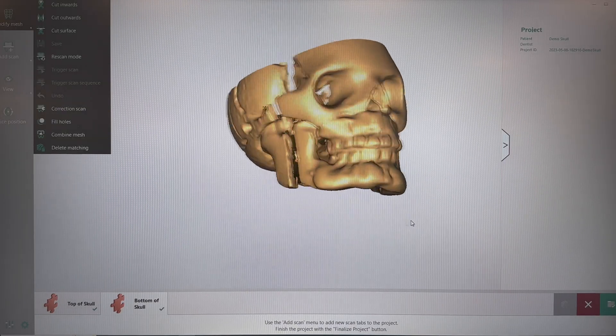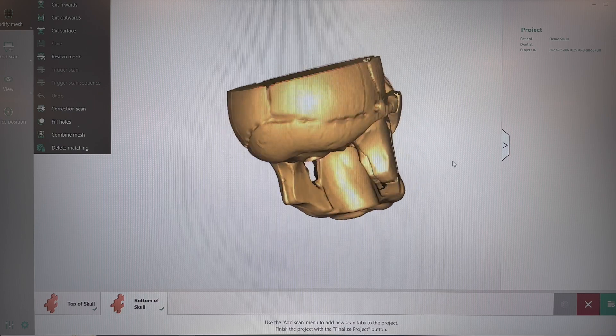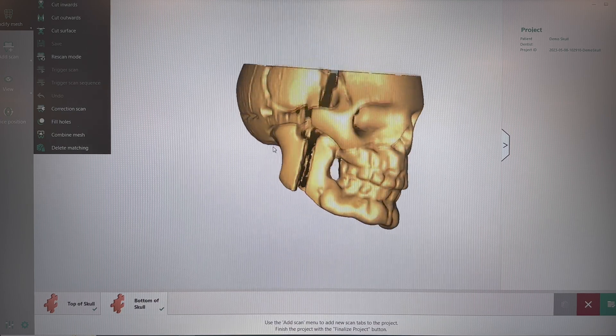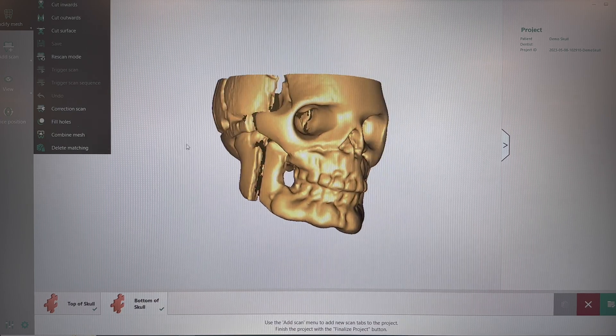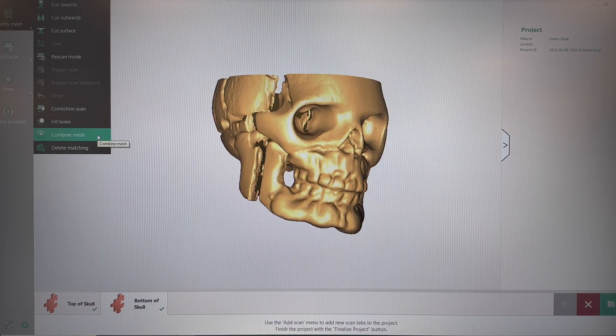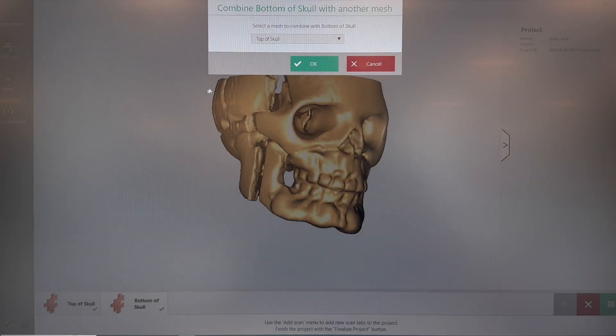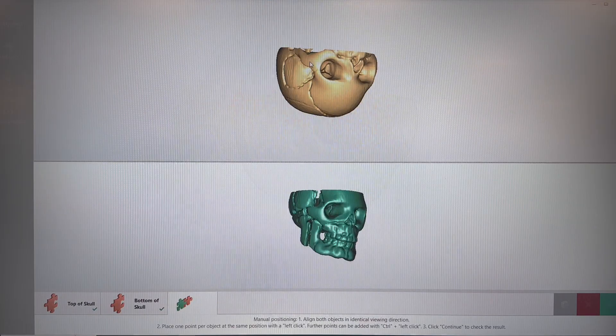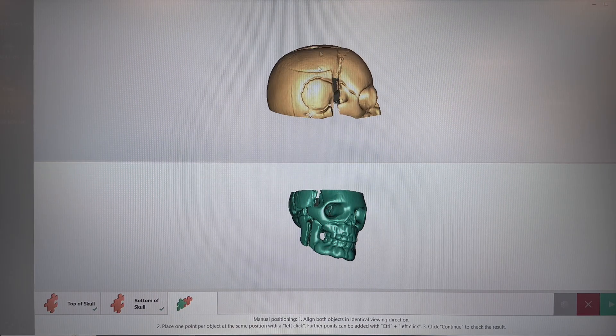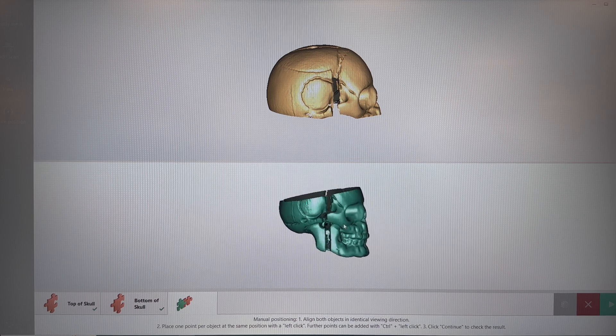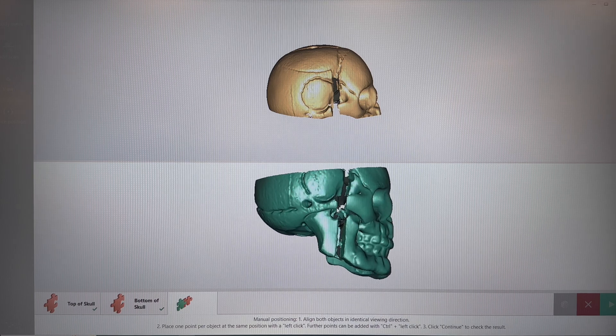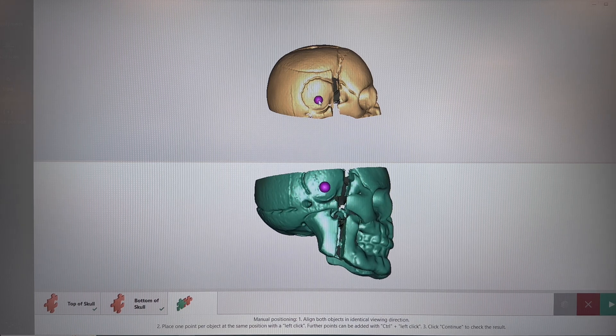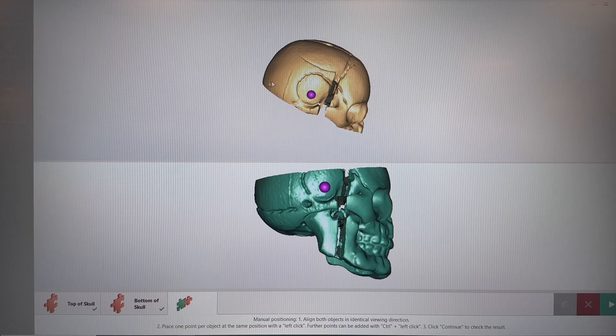Now we need to combine the two meshes. To do this, on the left side, click the Combine Mesh button, click OK, and we're going to get them in the same orientation. Once you do this, left click a dot on each one in the same position.